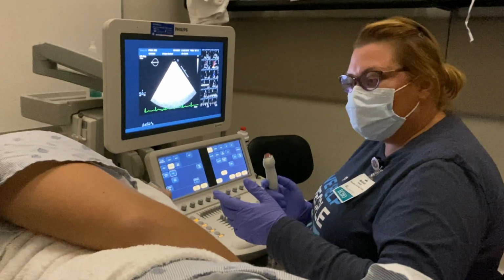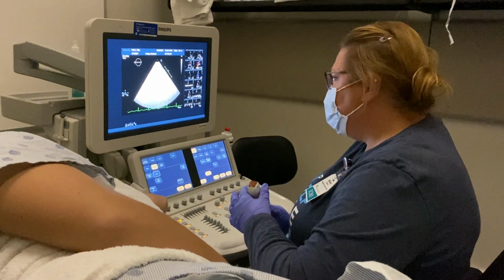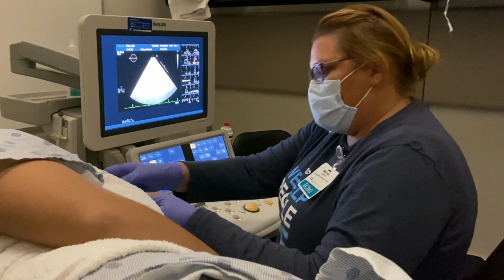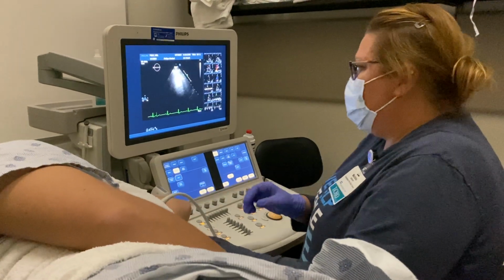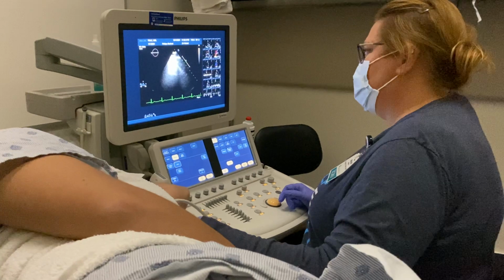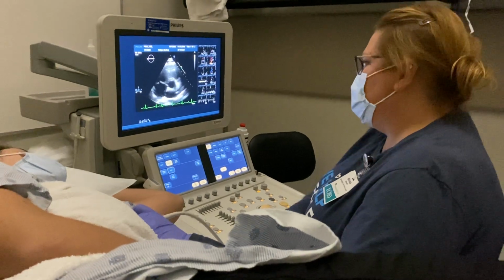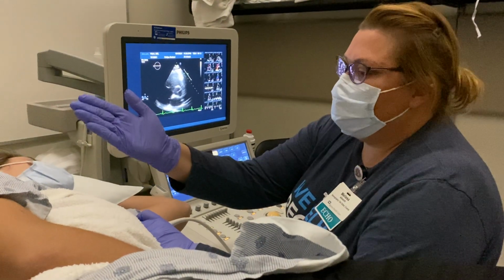Okay, and now we're going to work on the parasternal short axis of the ventricle level. Depending on where you've ended, if you probably have ended at the great vessel level, there's two things you can try here. So just get back for short axis really quick. Now I think you're too rolled up, Abby. There, right about there.